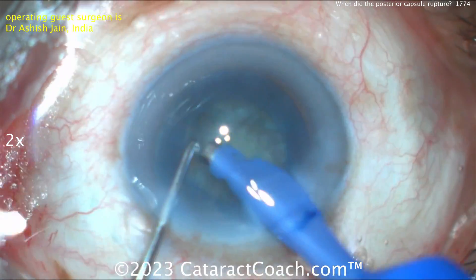The posterior capsule is open — you can see that vertical line. Something happened. Forgive the black flashes, there was an issue with the original video sent to me. The posterior capsule is definitely open. Now what are we going to do? Take out the cortex — I like that — but you've got to be careful because as you keep taking on this cortex you may start pulling on vitreous. I don't know if the anterior hyaloid face is intact or not; if it is, you're lucky, but more likely it's going to be disrupted and you're going to have vitreous prolapse.